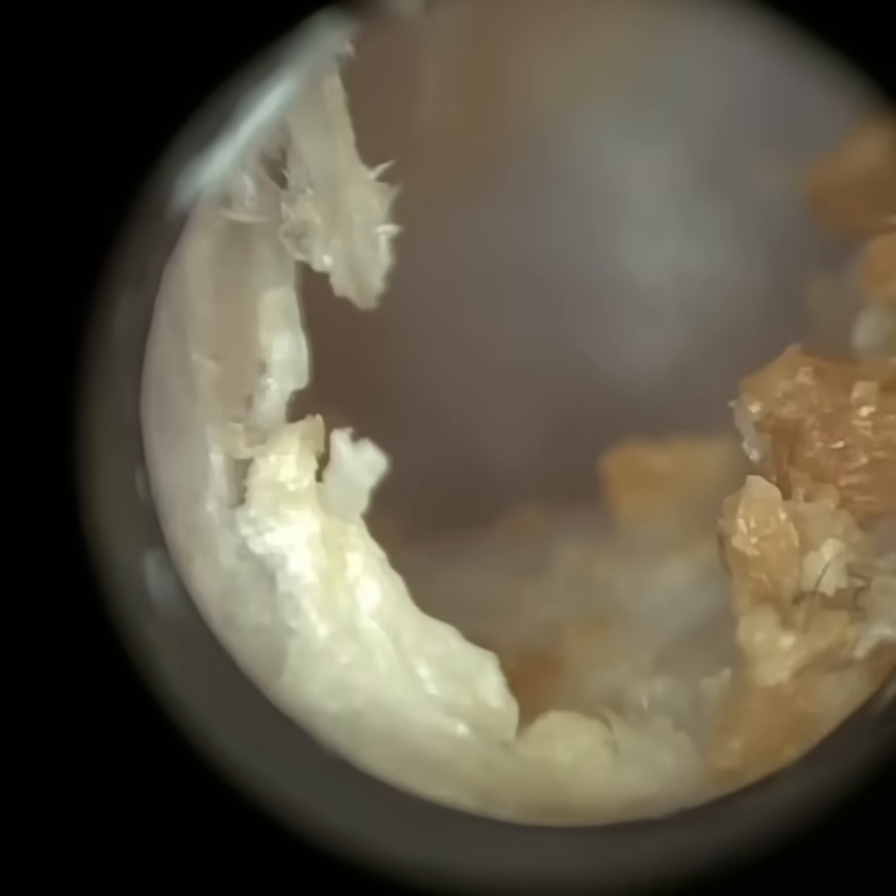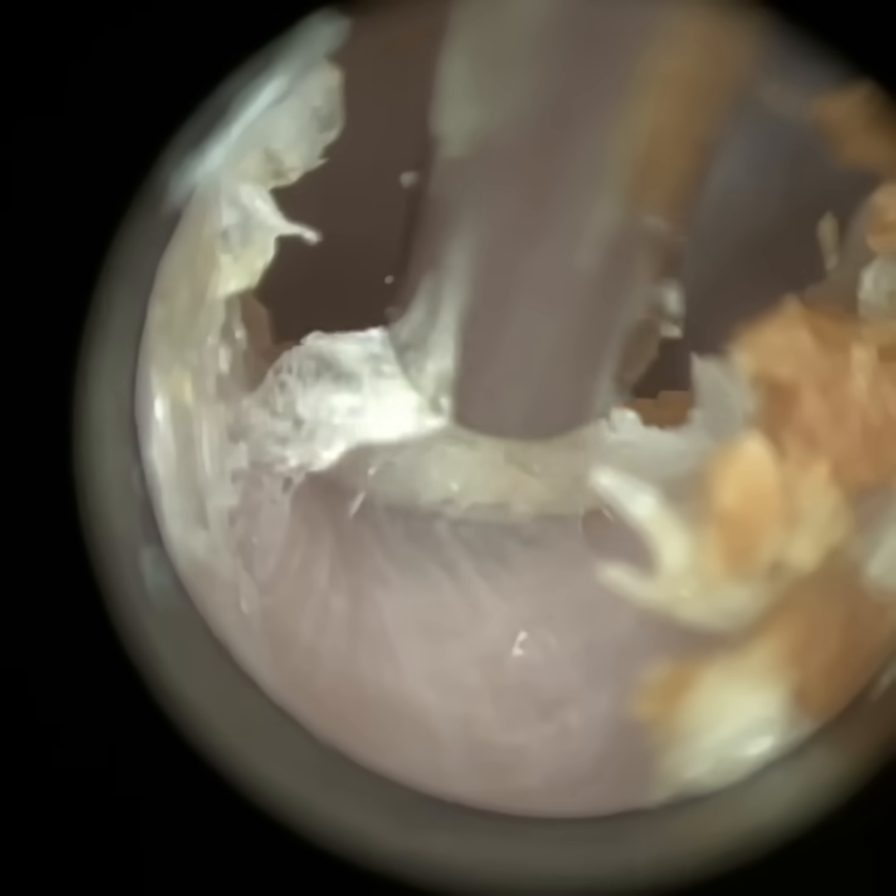This patient has got very sensitive ears, so it was quite a good procedure to perform with the Waxscope. Even taking ear impressions in the past has been quite tricky because the slightest compression or contact with the canal wall can be a bit uncomfortable for them — more so their left ear. I've already cleared the occlusion so they could hear significantly better. I've got the major plugs of debris and dead skin away, so I'm just trying to mop up as much as I can, avoiding any contact with the canal wall.